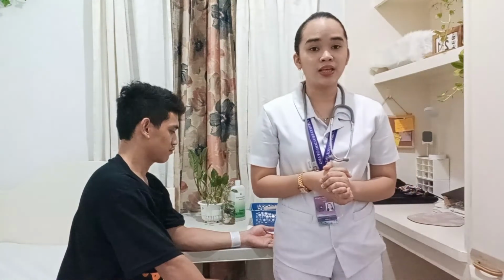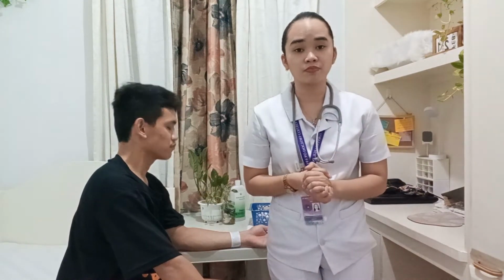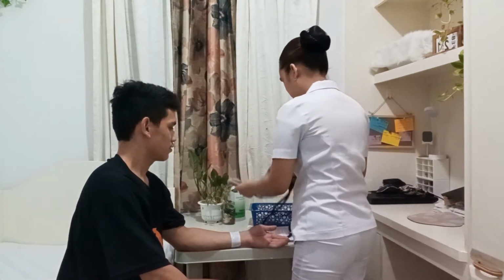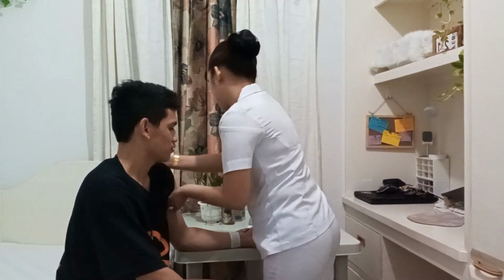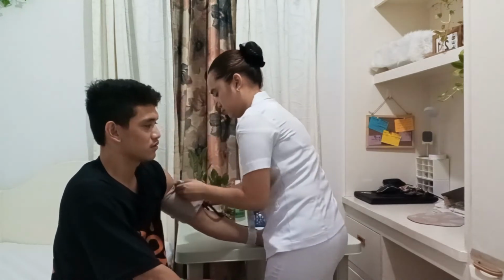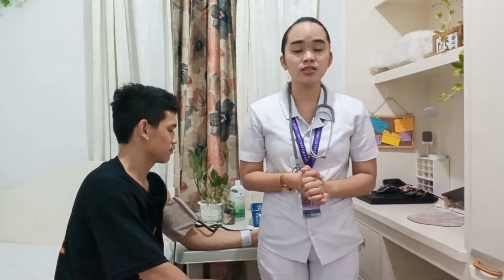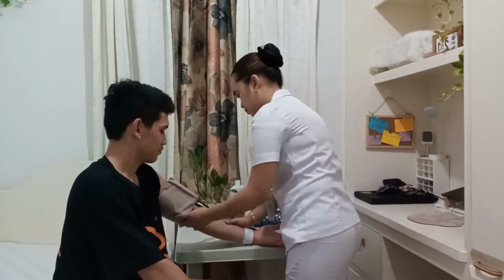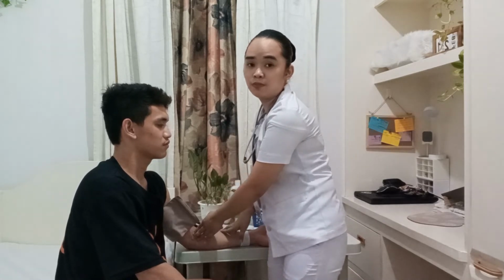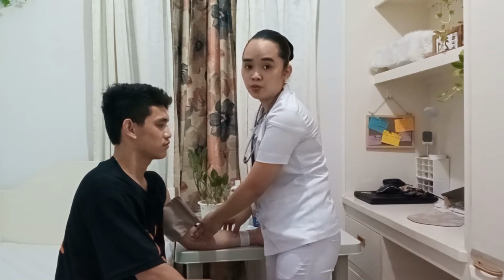Now, I'm going to place the cuff around the arm of my patient, about 2.5 centimeters above his antecubital space. Okay, now I'm going to palpate his brachial pulse using my 3 fingers. Once I have found the brachial pulse, I'm going to inflate the cuff until I no longer feel the pulse.